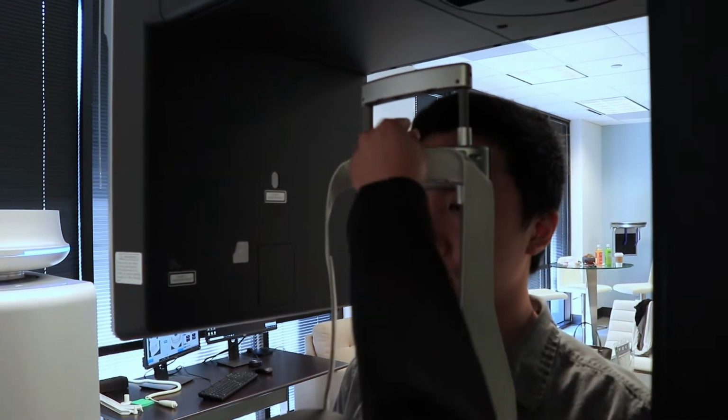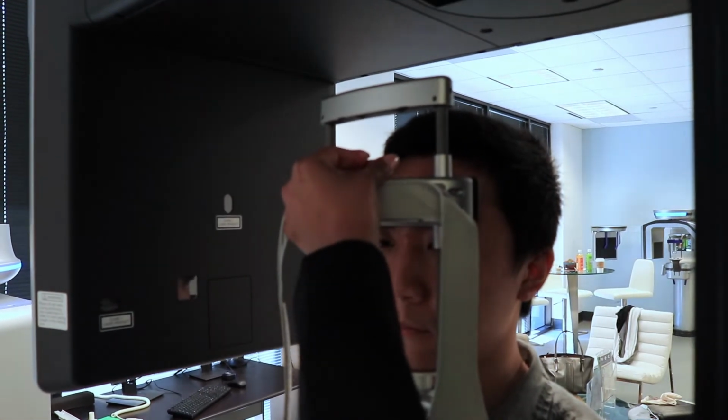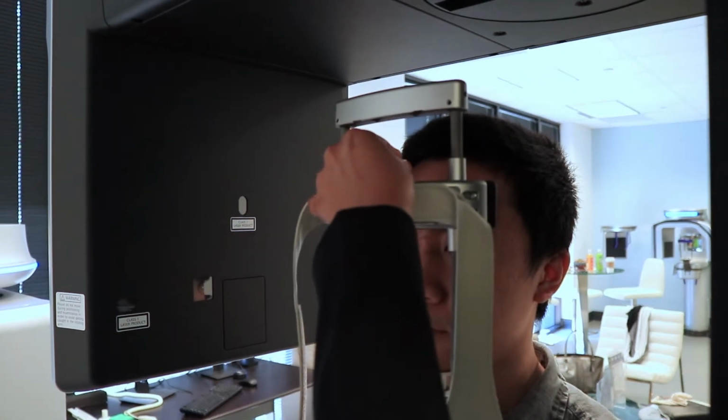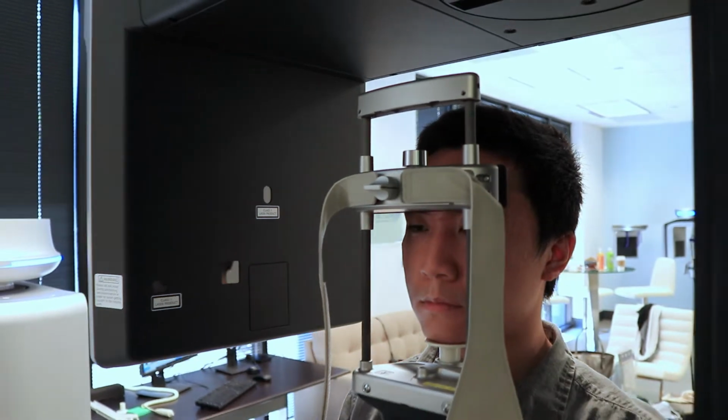Turn the top knob to the left 2 to 3 times to loosen it and gently push it forward to meet the patient's forehead. Turn it to the right to tighten it up and lock it into place.